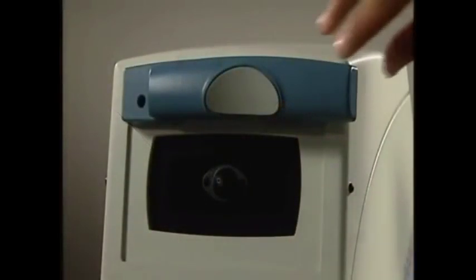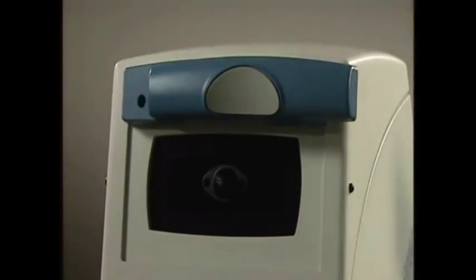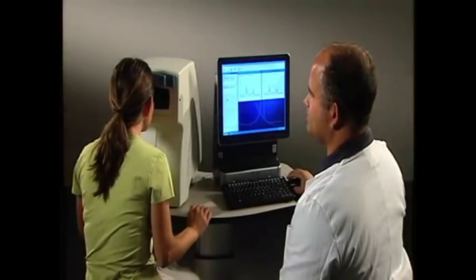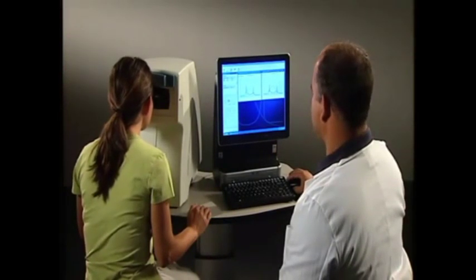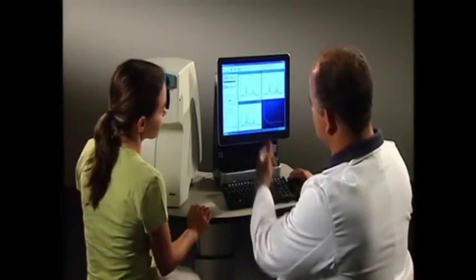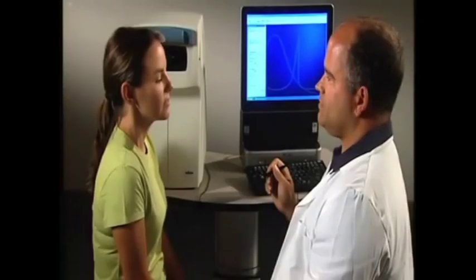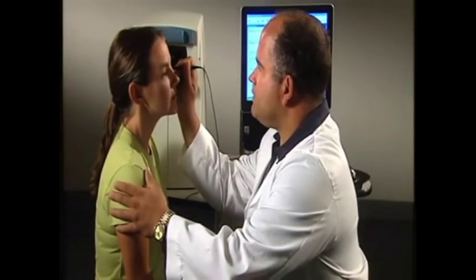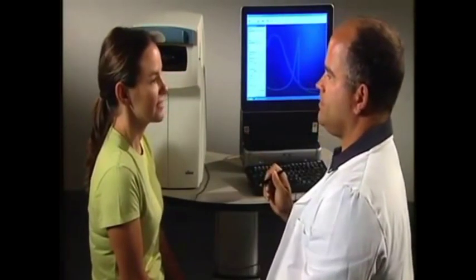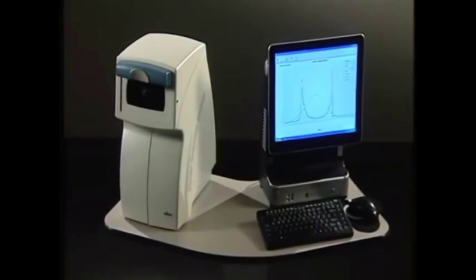Patient positioning is easy and comfortable, thanks to the left-right sliding headrest and the easy-to-find fixation target. Best of all, the Ocular Response Analyzer utilizes a non-contact measurement methodology, so no anesthetic is required. Our patented hands-free automatic alignment system makes it easy for any member of your staff to perform the measurement. The instrument includes a convenient built-in ultrasound pachymeter, so operators can conduct multiple tests at the same workstation. The CCT data are captured and stored along with all of the other measurement results.